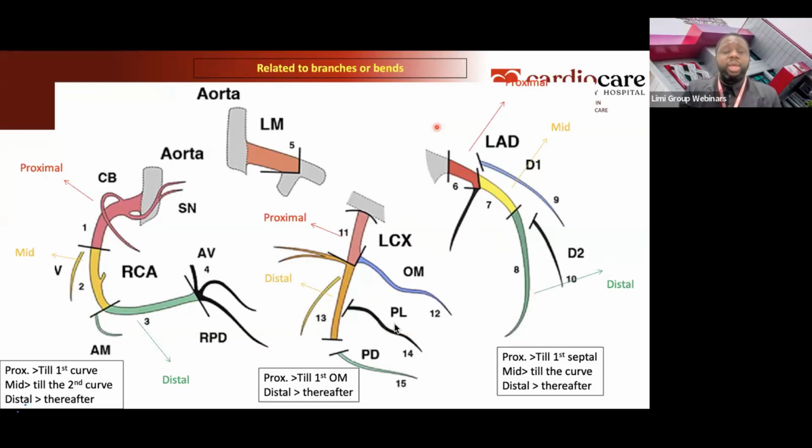I talked about this at the beginning. So if you came late, for the person that asked this question, we talked at the beginning about the different reasons why we do a coronary angiogram. If somebody has an MI, you cannot go and be doing CT because you need to be able to intervene immediately. Another thing is that you are giving dye for both of them. You want to give dye and intervene immediately rather than give a higher amount of dye in CT.